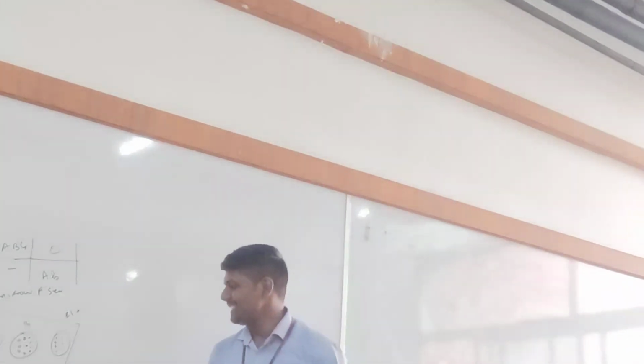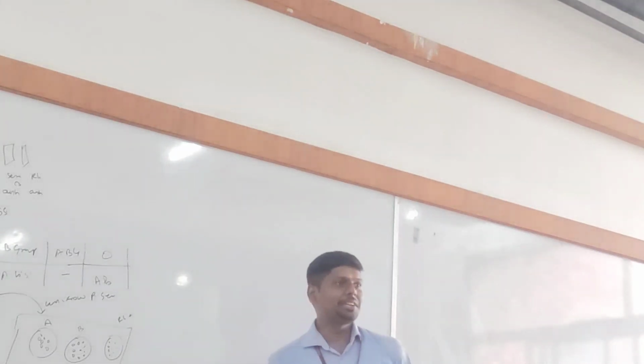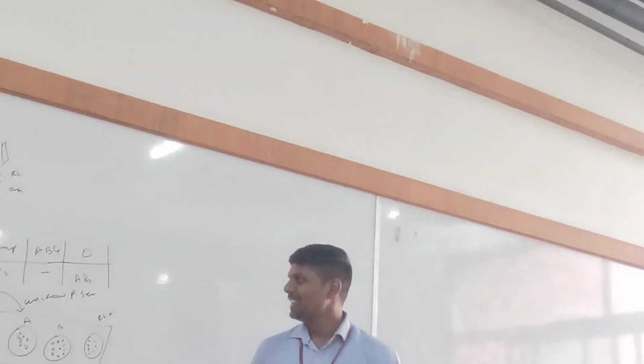I got this is A negative. This group will be A negative. Do you understand why? You didn't? Listen.